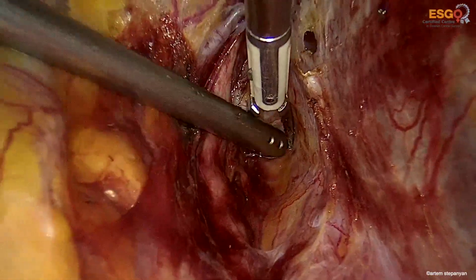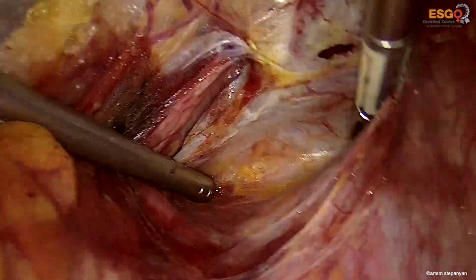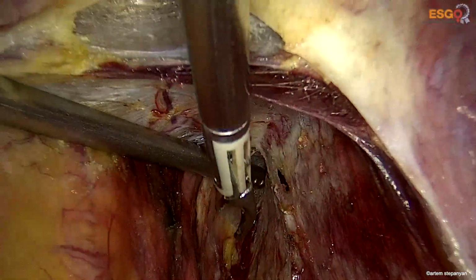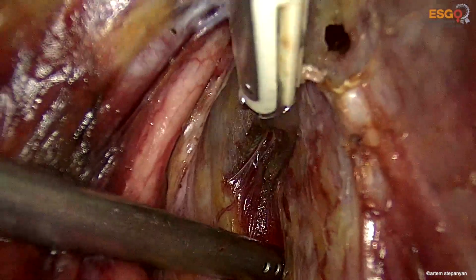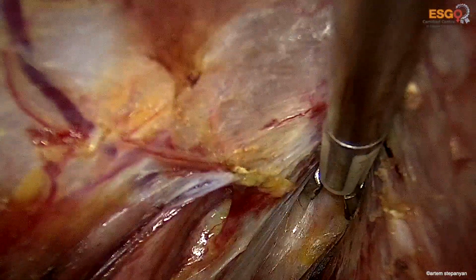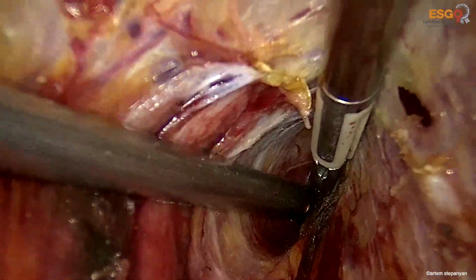By means of a grasper and suction tube, we bluntly dissect the Okabayashi space towards the pelvic floor, so that we automatically detach the affected pelvic peritoneum from the underlying anatomical structures.